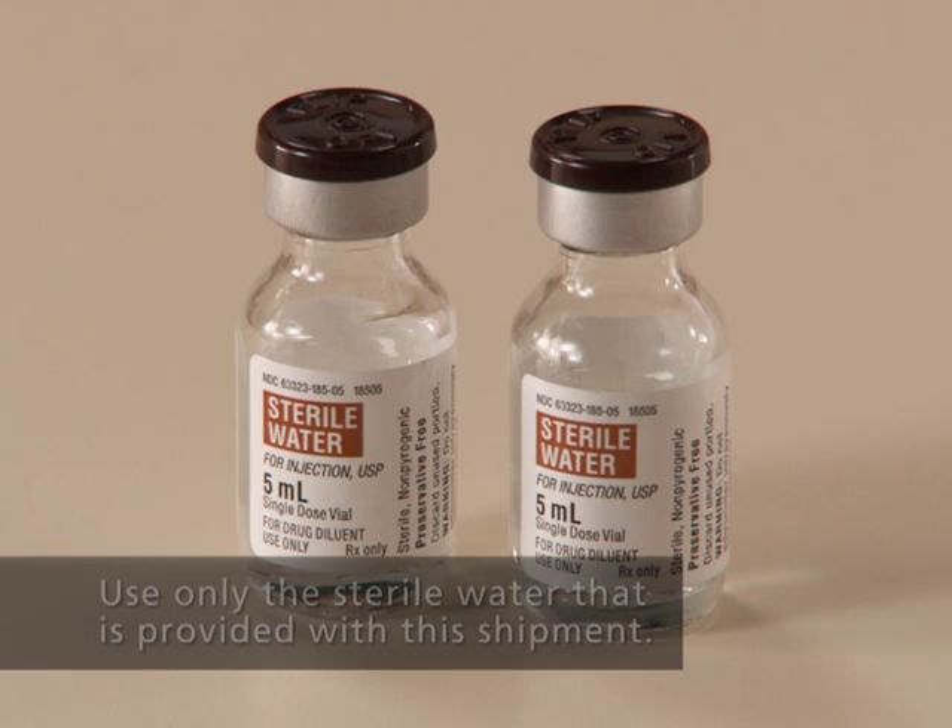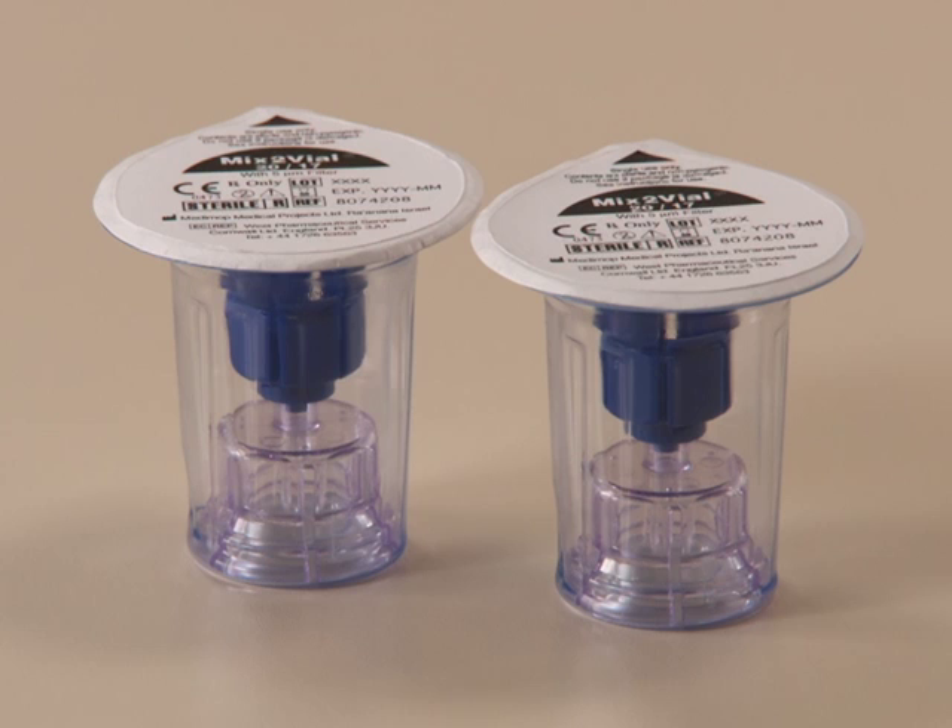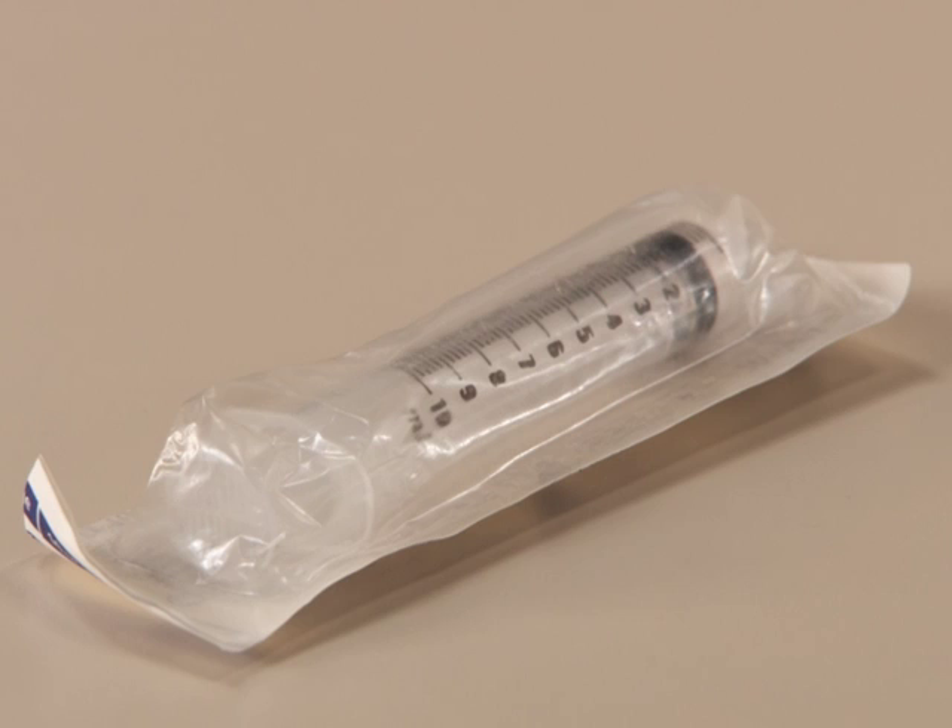You'll need the following supplies to begin preparation: two vials of Synrise; two vials of sterile water for injection, USP, diluent 5 milliliters each; two Mix 2 vial transfer devices; two alcohol wipes; and one 10-milliliter syringe.